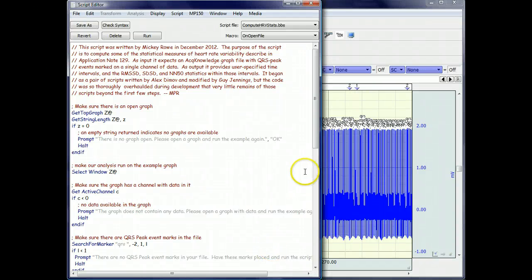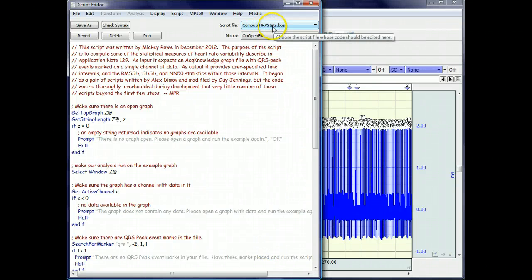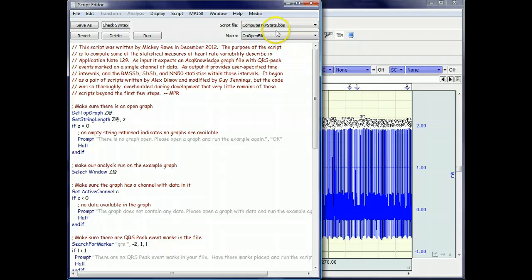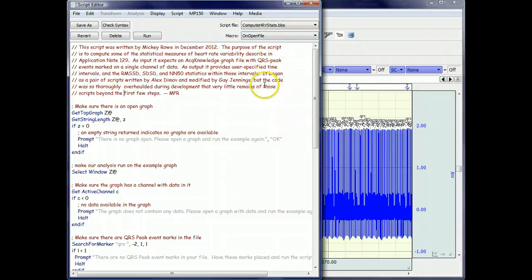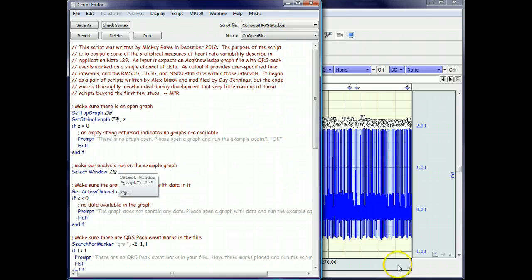The purpose of the script, Compute HRV Stats, is, as the name implies, to compute various statistics associated with heart rate variability.